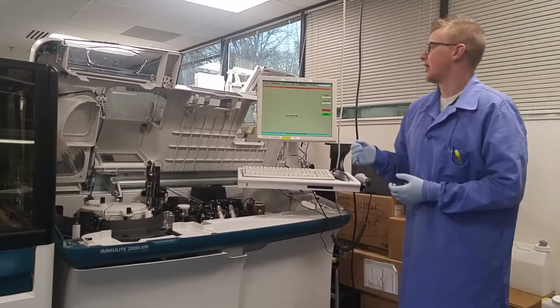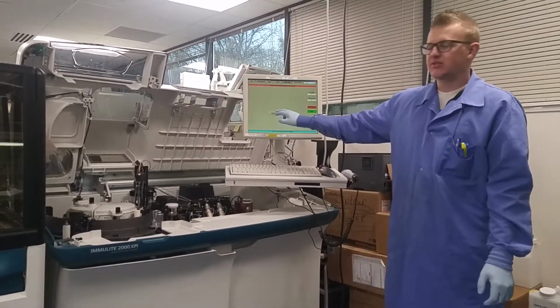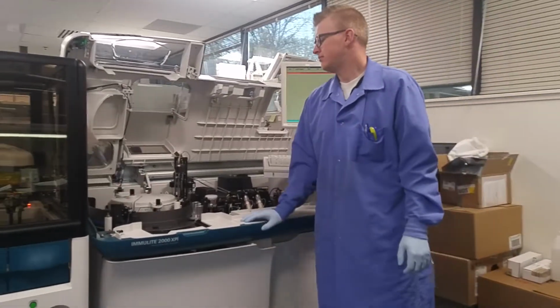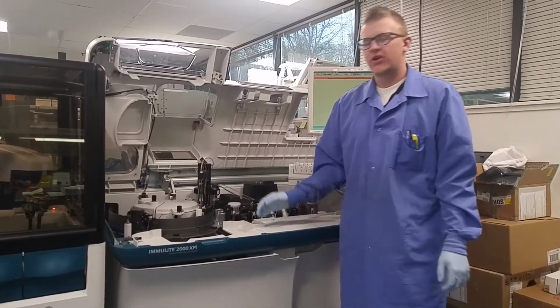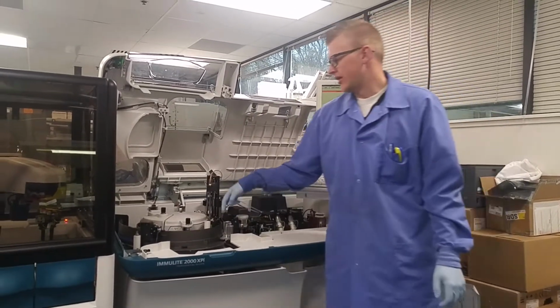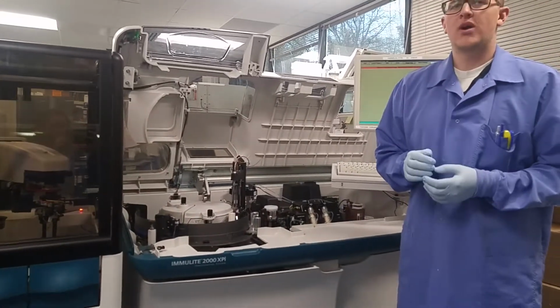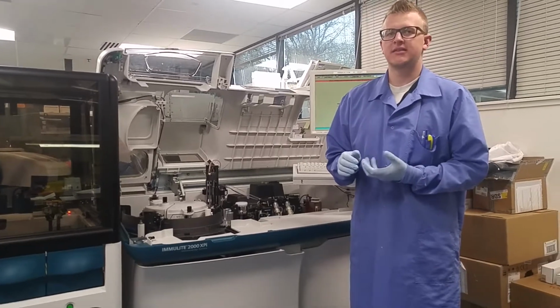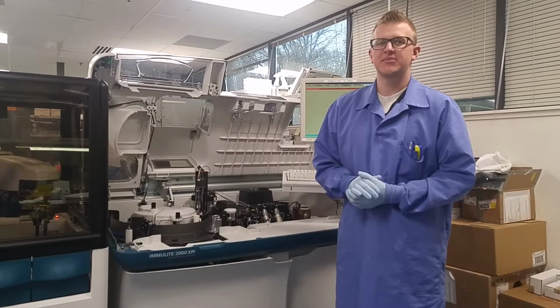Next message is to press button to observe sample probe dispense. Once you press this, it will dispense water out of the probe. So what you're looking for now is to see that water is ejected out of the probe and goes directly into the blind hole. If you're unable to see the water going into the blind hole, it could be that an internal Clot is obstructing the system. And in that case, you would need to repeat the previous steps and start over again.